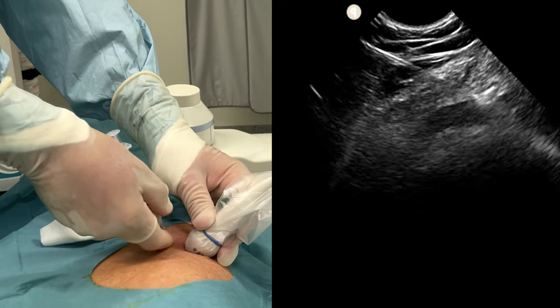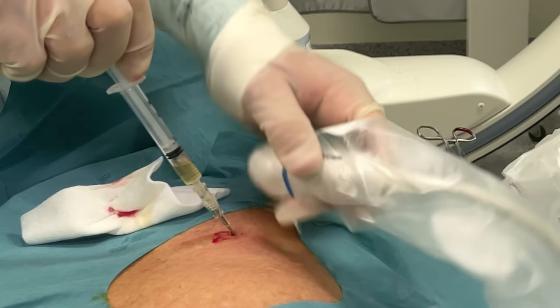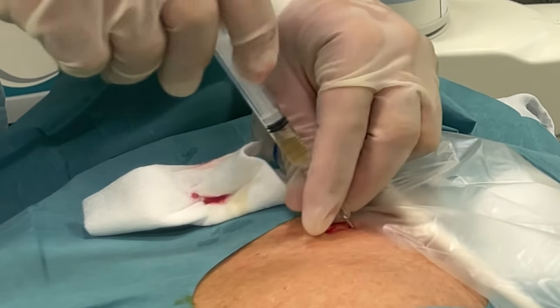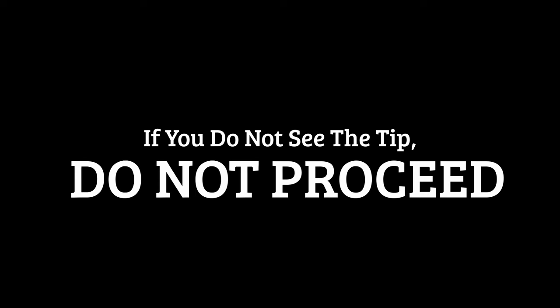A 2cc syringe attached to the steel cannula acts as a handle, which facilitates tip control. Note the very clear puncture of the pericardium and visually confirm that the cannula enters the black void that is the effusion, away from the beating heart. There's no need for continuous aspiration. Our guiding principle for all cannulation is: if you do not see the tip, do not proceed. As for any in-plane cannulation, lateral displacement is a key skill. See our videos on Central Lines for tips on cannula handling.